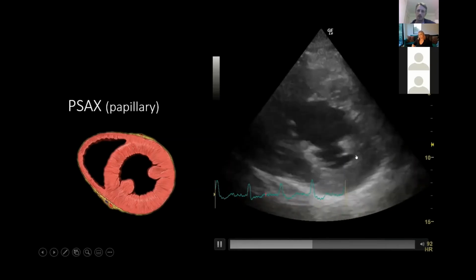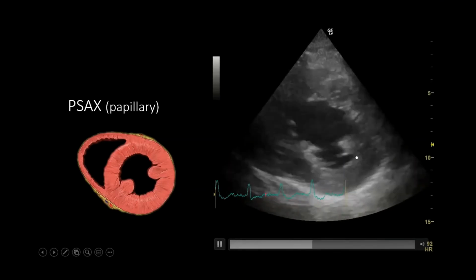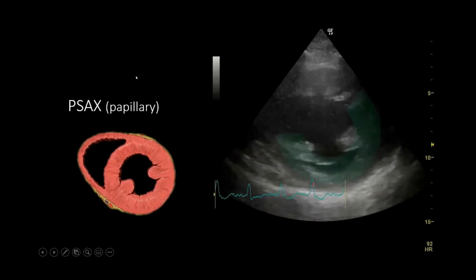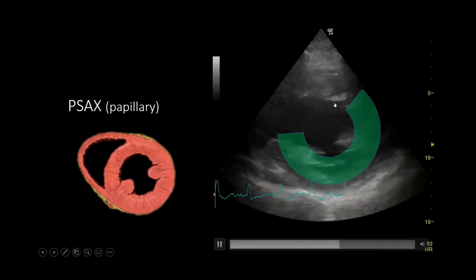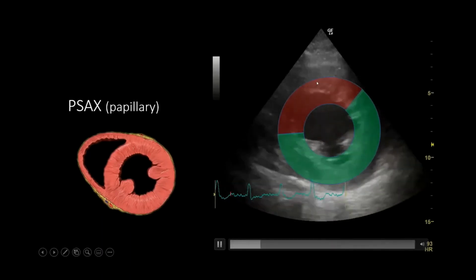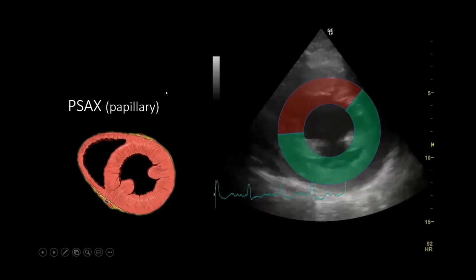Now, is the left ventricular wall contracting nicely? How's it all contracting together? And if you look with the eye of faith, you can say this bit looks probably pretty good, but actually up where the interventricular septum is and anteriorly, that's sort of flapping around.